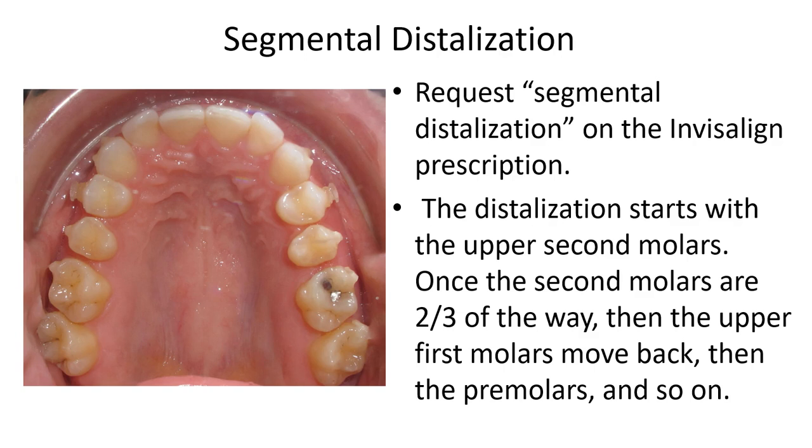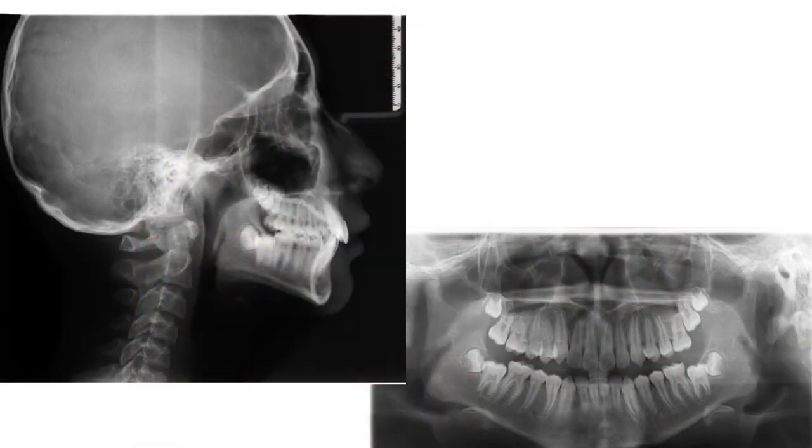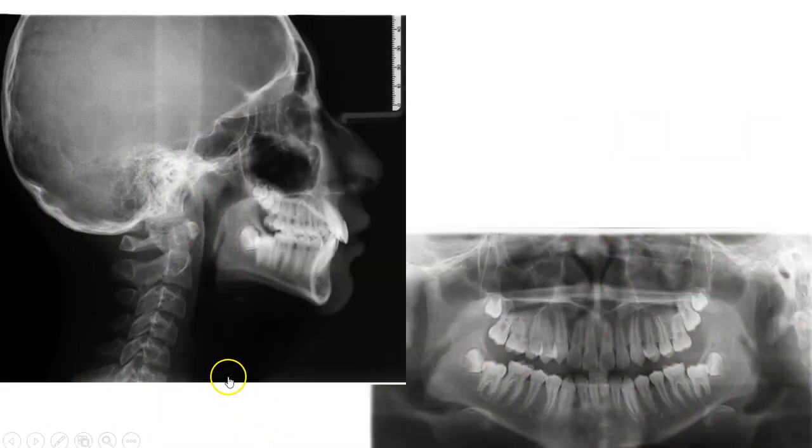When you do segmental distalization there's a reciprocal mesial force that you need to capture with a class 2 elastic. Here is a case example combining what we've been discussing: a young man presenting with a class 2 subdivision right, deep bite malocclusion. Our goal is to distalize the buccal segment. You can see how nicely things have turned out. We'll go through the ClinCheck to see exactly how we got there — that was his refinement just shown.